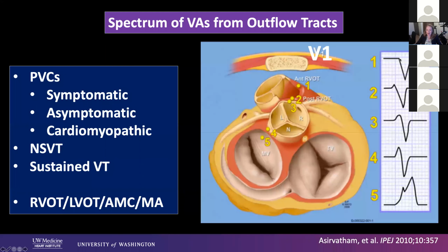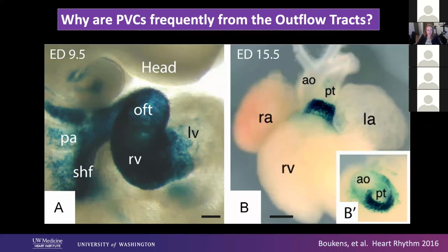So there's no R wave here at the beginning of the QRS. Even moving into the posterior RVOT, you should get some R wave, and it tends to be very narrow. As you move more posterior into the cusps, and then certainly into the summit area, which we'll talk about, you start to get a broad R wave here. And then into the aorta mitral continuity, a much more broad R wave. And along the mitral annulus here, you get full positivity. There isn't really very much muscle posterior to the mitral annulus itself underneath V1 that's going to cause depolarization to be moving away from that lead.